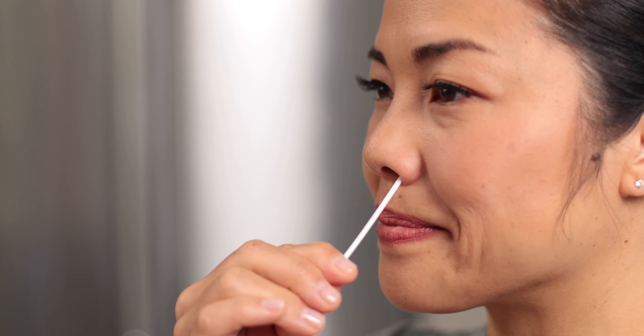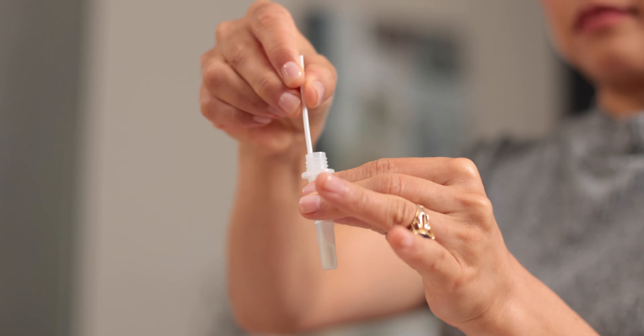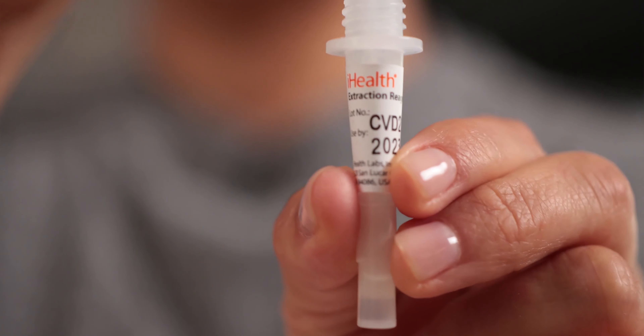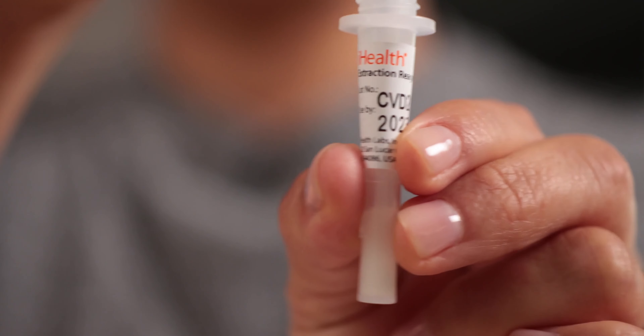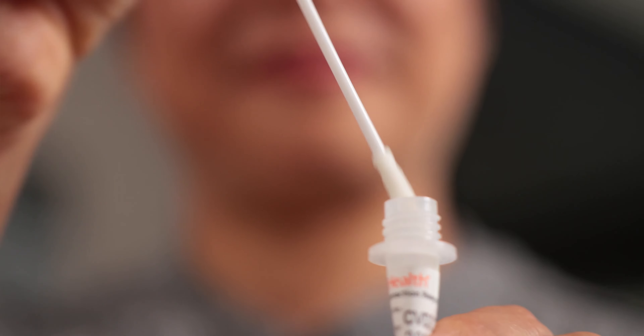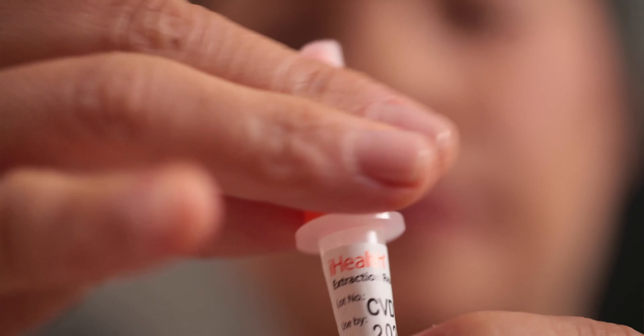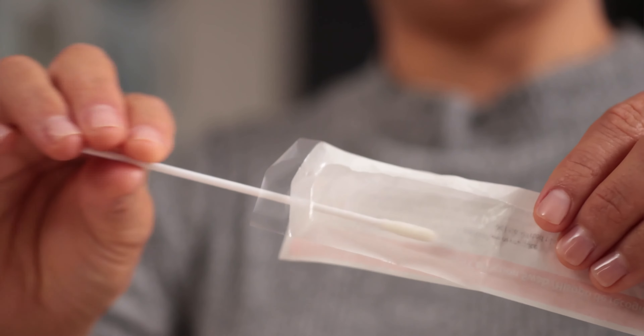When you've finished, swab your other nostril the same way. You think you got it bad? I'm the one who has to keep saying nostril. Insert the swab all the way into the solution. Twist it back and forth in the solution at least 15 times. And, as you're removing the swab from the tube, squeeze the sides of the tube to wring every last drop of solution and sample out of that swab. Then replace the large lid back onto the tube.